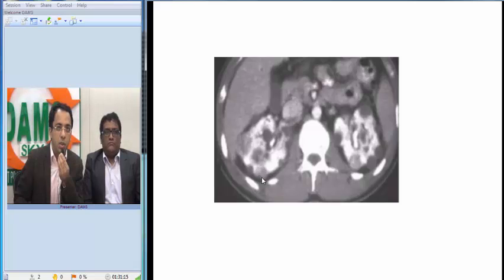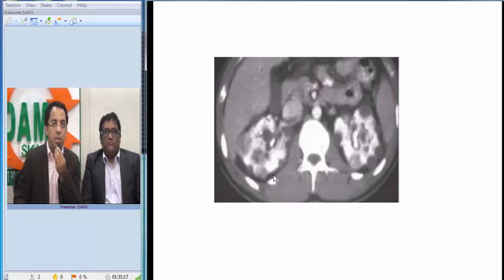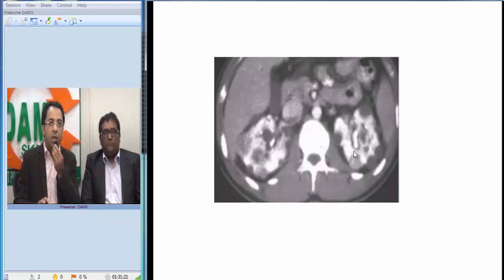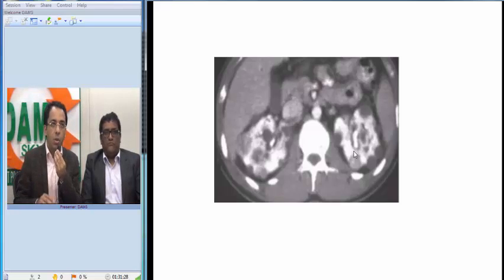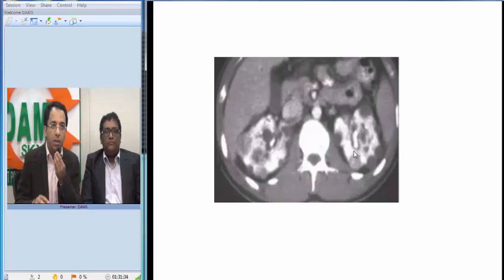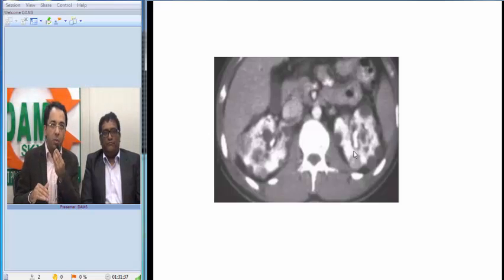This lesion is not a cyst — it is more solid and more enhancing. Looking at this image again, the patient has bilateral renal cystic disease, but not all of them are cysts. Some are more solid-looking on CT with solid components, enhancing components, and septations, which makes me suspect they are of a more complex nature — possibly of neoplastic etiology.